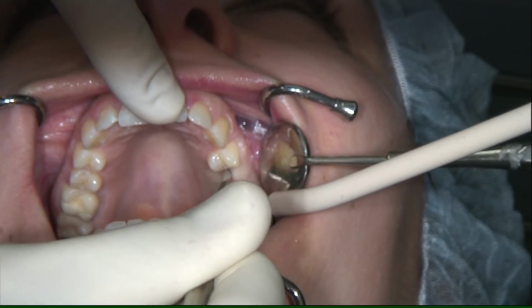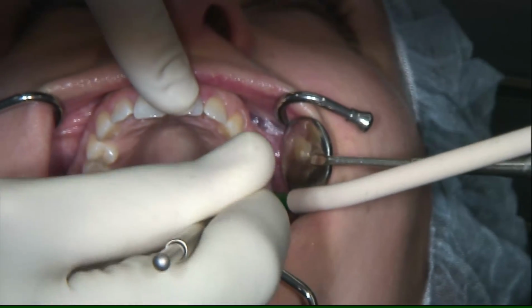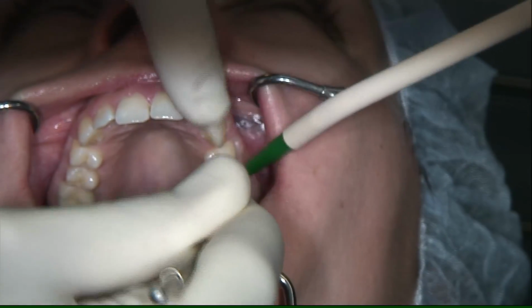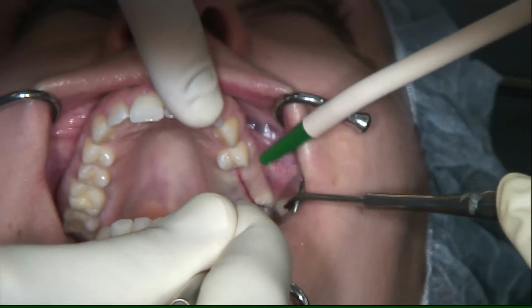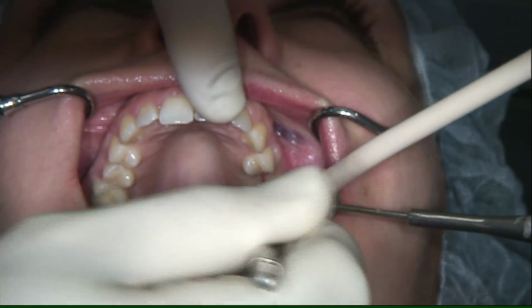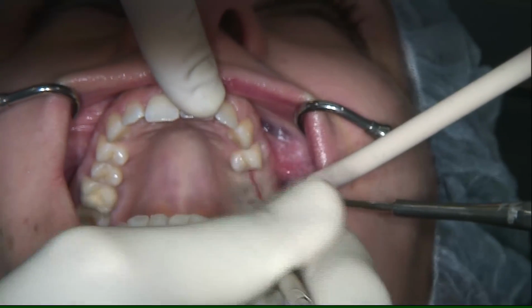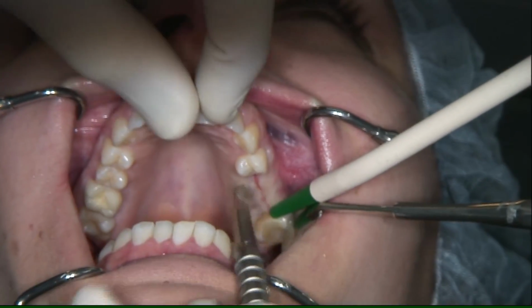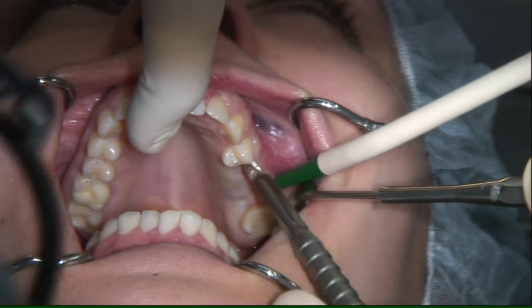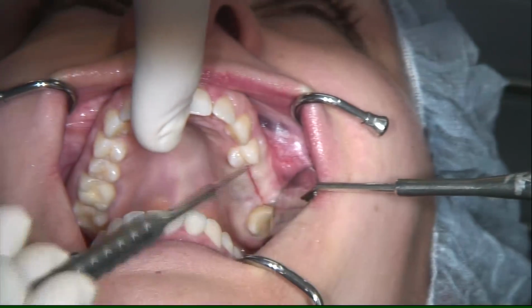I don't want to bore you with too many studies, but a very interesting study from Kleinheinz 2001 showed that an incision in the middle of the crest is preferable because we keep the blood supply, because the blood vessels meet in the middle of the crest. We try to avoid relieving incisions, also to keep the full blood supply.